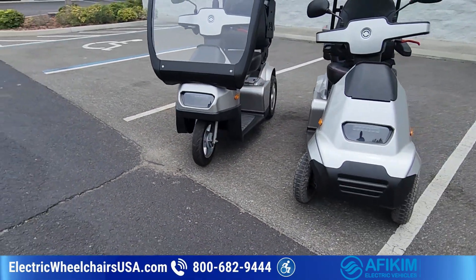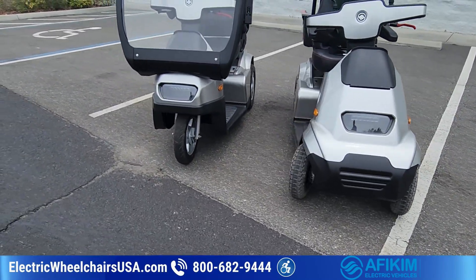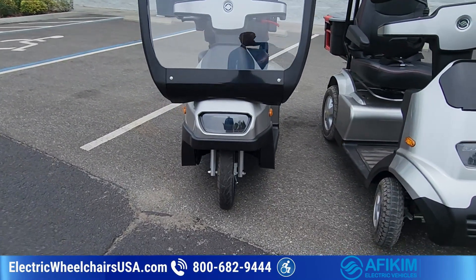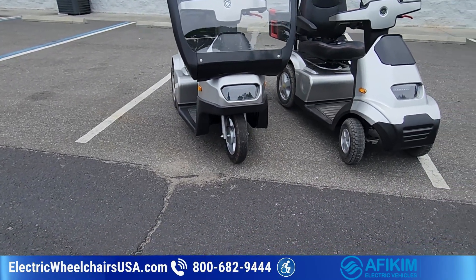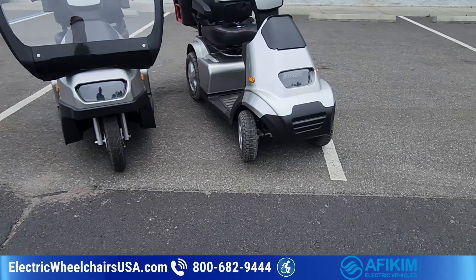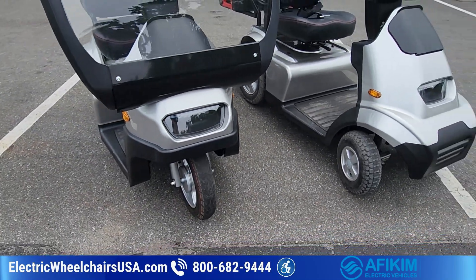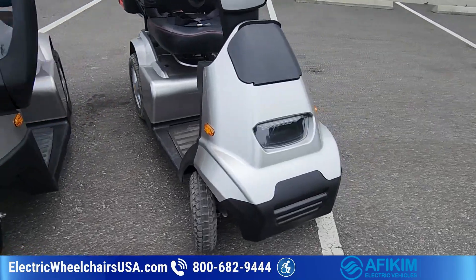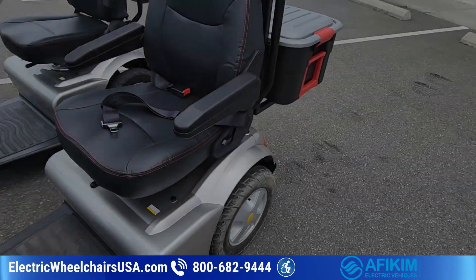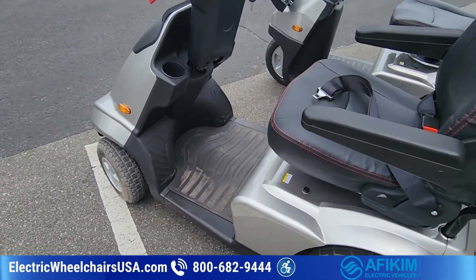The S3 is a three-wheel scooter and the S4 is a four-wheel. A lot of people want a three-wheel for the better turning radius — you can make sharper turns. With a four-wheel, you have more stability. That's the major difference. Some people prefer a three-wheel, some prefer a four-wheel. We sell more four-wheels than three-wheels, but it's really up to you.